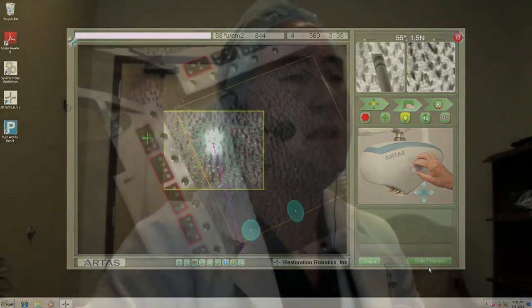Okay, so if you were watching me about a year ago, we were having to go through and set those devices, but there are algorithms that in the first 3 or even 4 harvest attempts, the robot will actually be able to adjust for that based on some feedback that it gets from these lines. Does that make sense? Hopefully so. That was written in, so we won't get a verbal response from that.